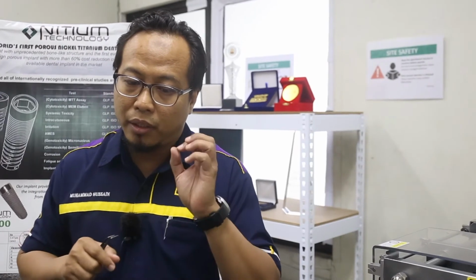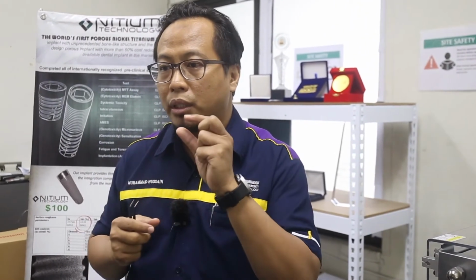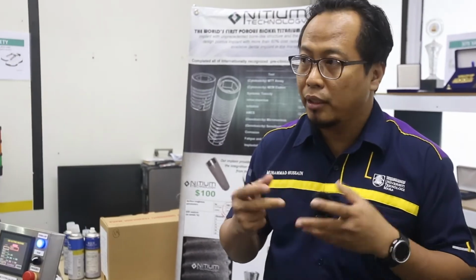Due to the mismatch, it will create another problem, which is stress shielding. In order to avoid stress shielding, we produce the porous structure so that we can reduce the stiffness of the implant. Therefore, it will create better mechanical properties and better fixation. When this porous structure is implanted in our body, the tissues can grow not only on the surface but also inside the implant structure.